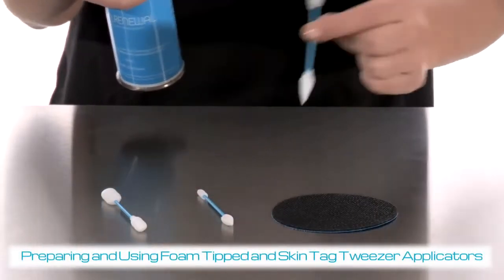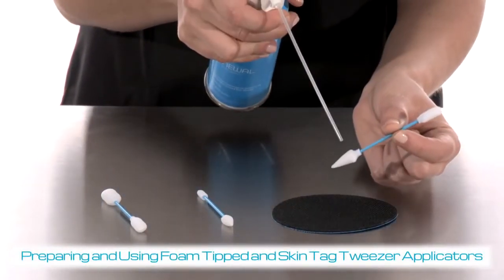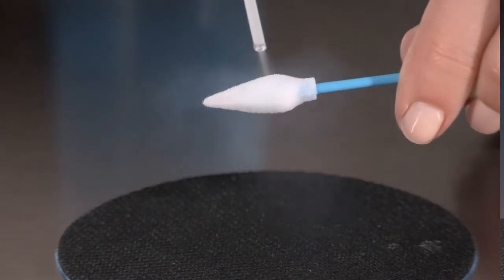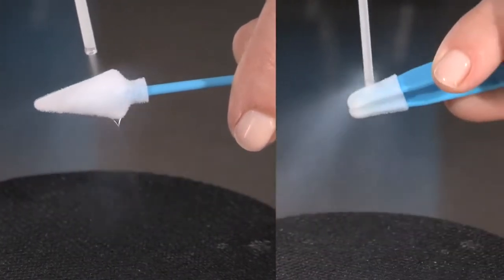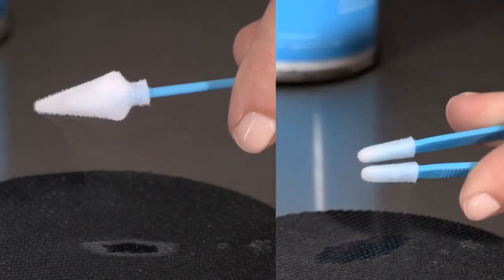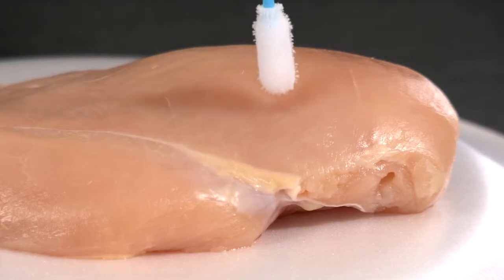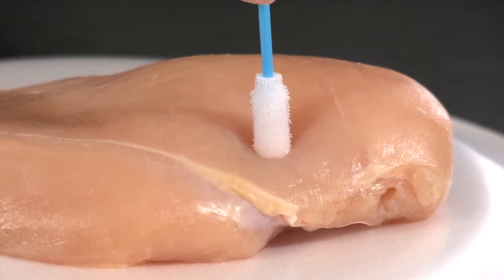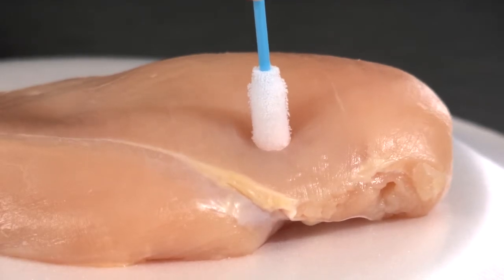Lightly spray directly onto the foam tip of the applicator until the tip drips at least one time. The applicator may be rotated to ensure complete saturation. Wait approximately 10 seconds for the foam to crystallize. If using a foam-tipped applicator, place the frozen foam tip directly onto the lesion and press down for 20 to 40 seconds.